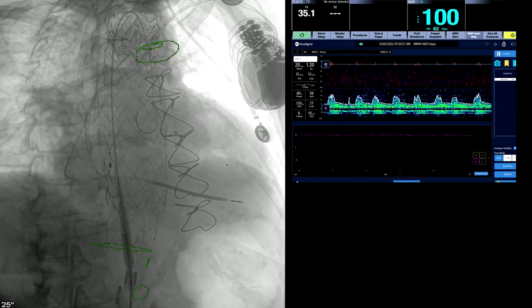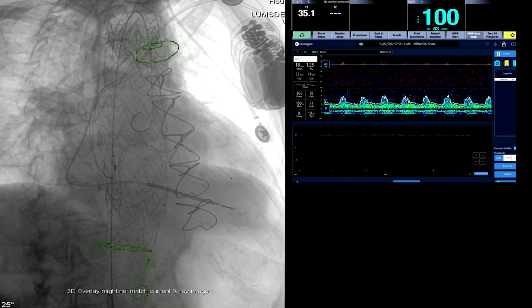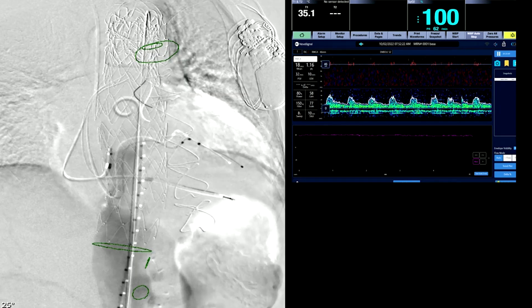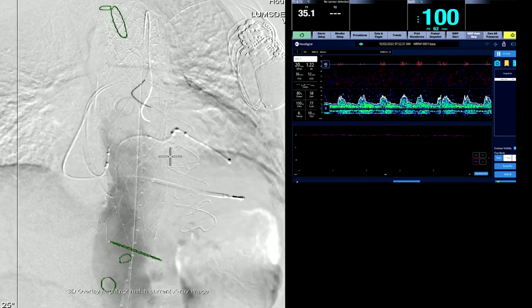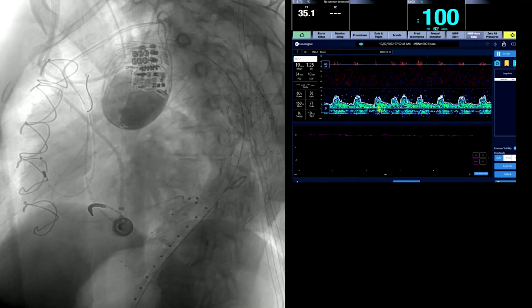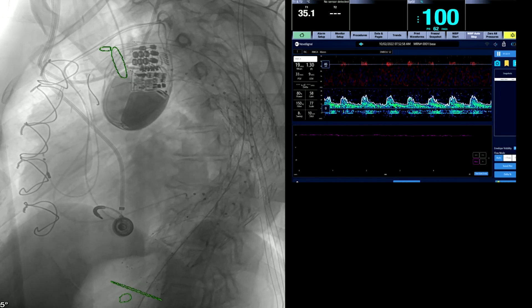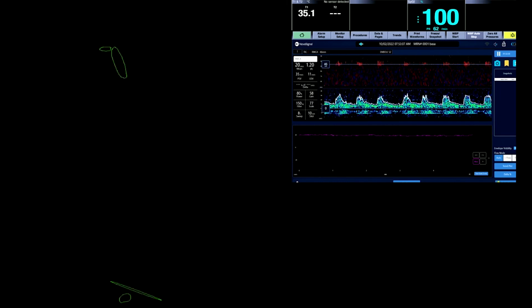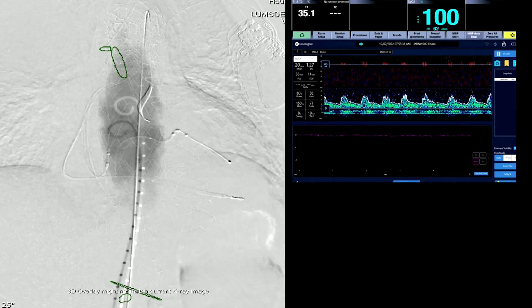The delivery system is being removed. We're going to balloon it and then do an angiogram. There's the angiogram at the bottom end showing the celiac still flowing, with no evidence of retrograde flow — type 1B. Now we're back in steep left anterior oblique. You can see the Lunderquist has come back a little bit. The pigtail has been put in position, and there's still basically a type 1A endoleak at the top end.